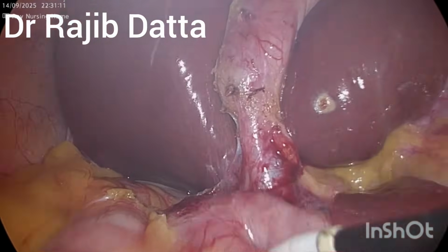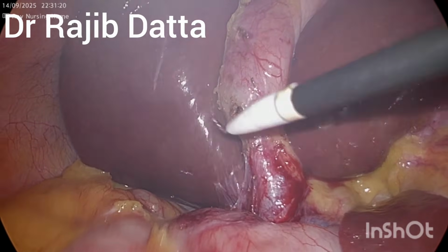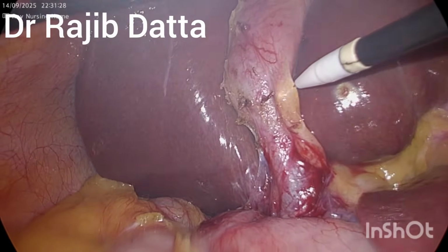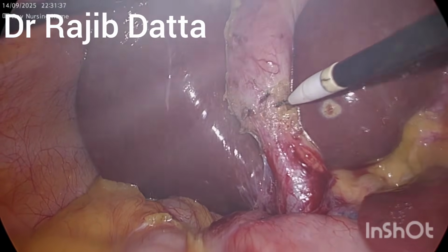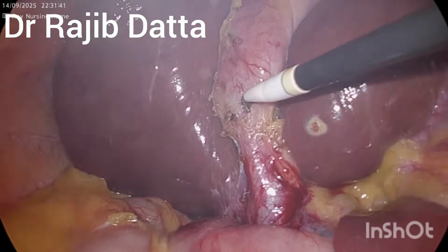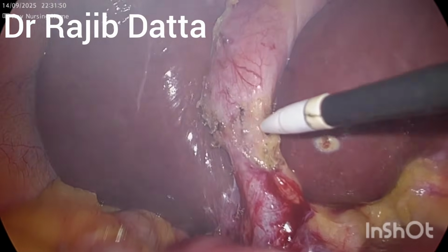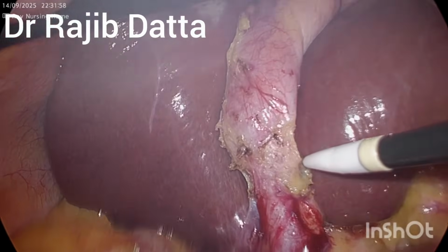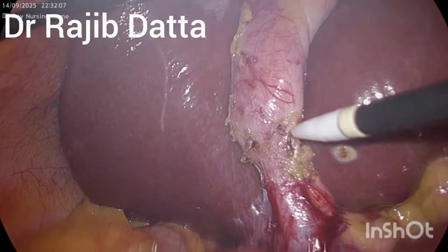Small bursts, and continuous changing of the traction and counter traction here is the main thing to make it more feasible. Now I am just separating it. The cystic artery and the cystic duct are going to be separated properly.